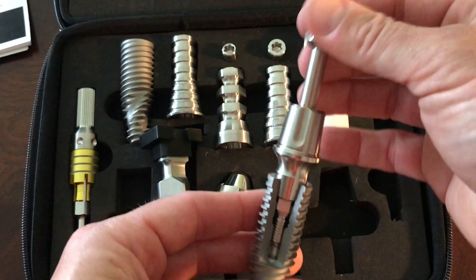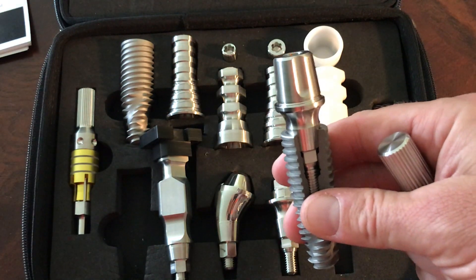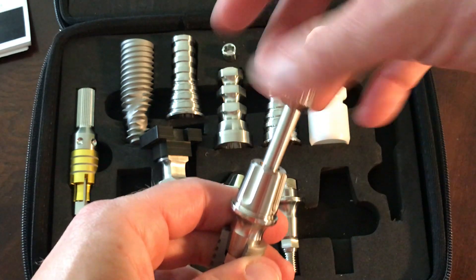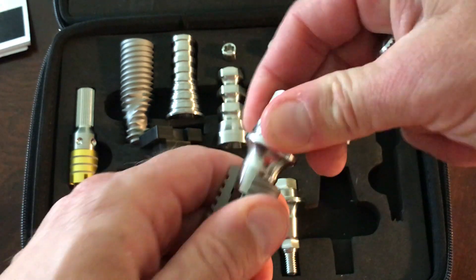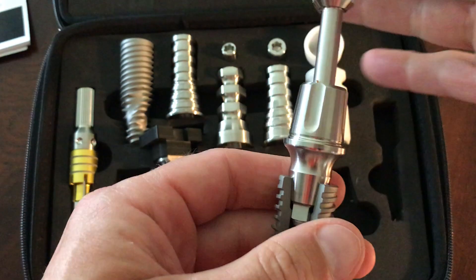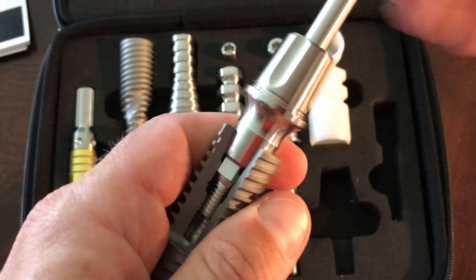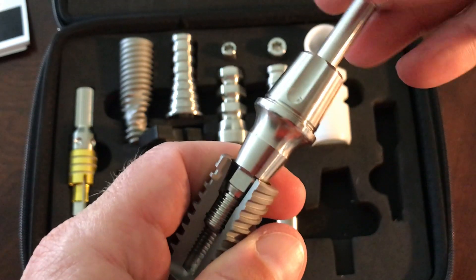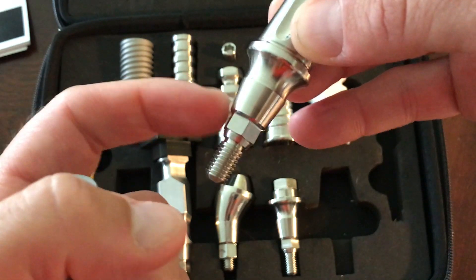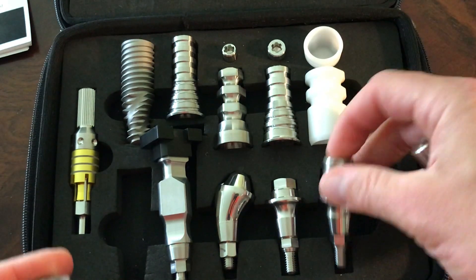In the CM system we have a platform switch, but when you go to actually remove the abutment, we used to back the screw off and keep turning until we heard a click, then had to grab the abutment and shake it and pull to crack that seal in the Morse taper. Now with this system, we put the screwdriver in and as we back the abutment off, it actually pulls and takes the abutment out for us in that Morse taper connection — a huge advantage, much easier for the restorative folks.